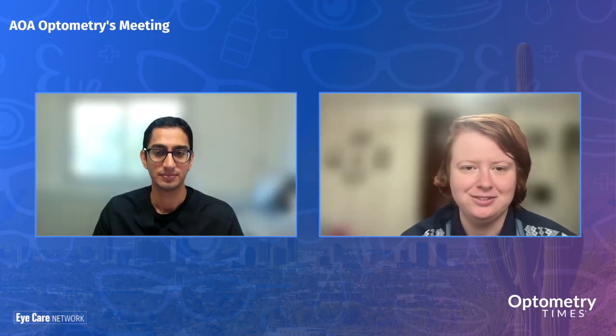Anything else from the talk that we didn't touch on that you'd like to mention? The talk has a lot of clinical imaging, a lot of cases, and I feel that's a great way to take away anything that I'll be teaching, and you can apply it to your own clinics at that point. There are basic discussions on pathophysiology, but at this point, it's just, what's important about this lecture? What can I take away? What can I put into my own practice? And that's what I'll be focusing on with the lecture.